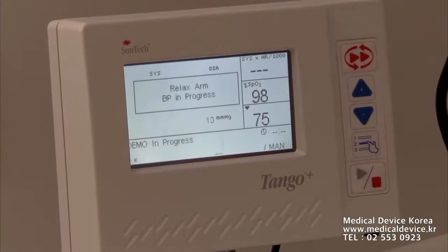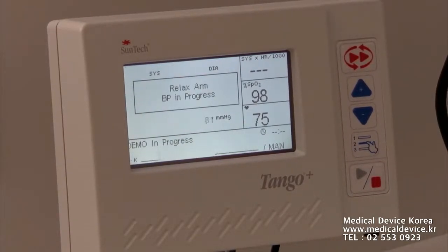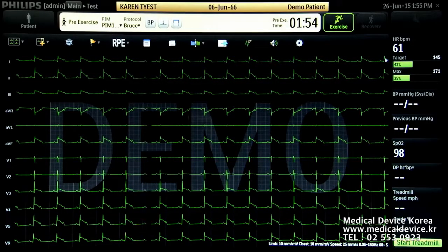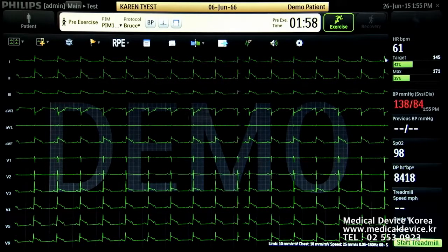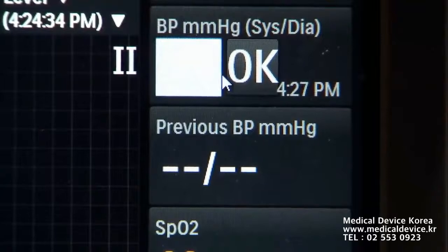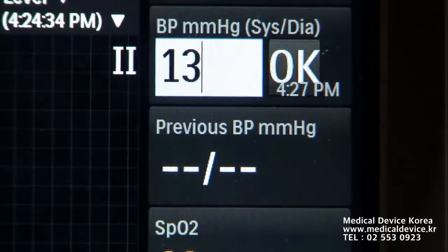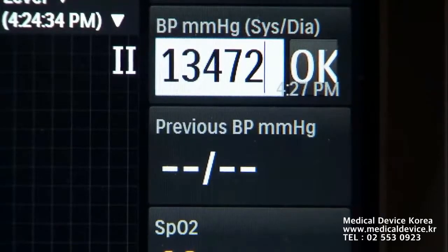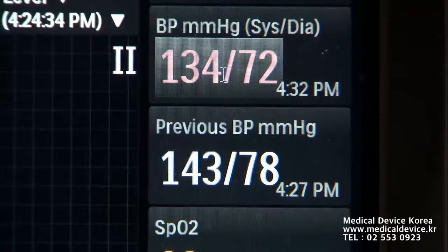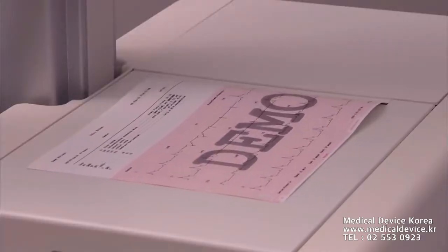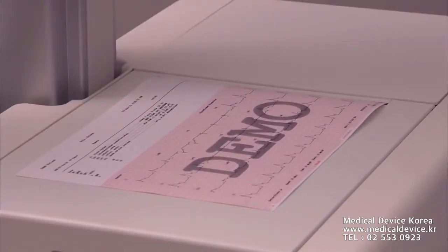Tango is our blood pressure module for stress. Some customers might not opt to have the Tango blood pressure module. If they do, the blood pressure will automatically populate at the defined intervals in settings. The BP box allows manual entry of the patient's blood pressure. A text box will appear for you to enter the blood pressure in the format systolic — must be three numbers. This creates an event label on the ECG recording.